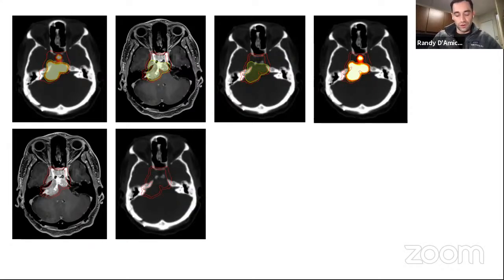Dr. Palmer, what's your modality of choice, or what are you limited to based on your institution? So in our institution, perfect question. Yeah, we do have a Gamma Knife machine. We have the Icon, which allows for both frame and frameless treatment. The other modalities that we have are LINAC-based radiosurgery techniques that can mimic a CyberKnife. We don't have a CyberKnife, but we have very similar treatment techniques that can deliver a 5-fraction radiosurgery.